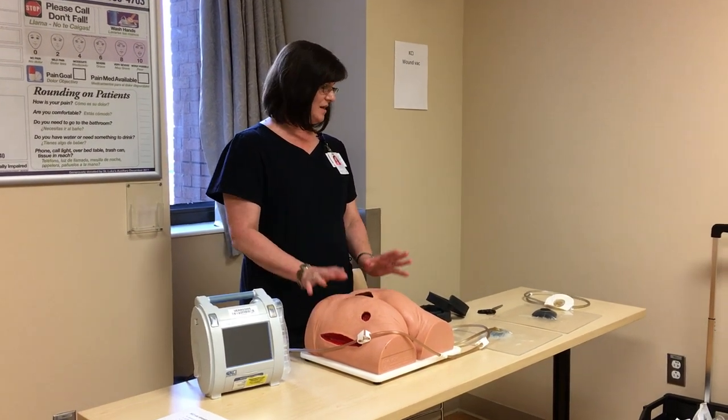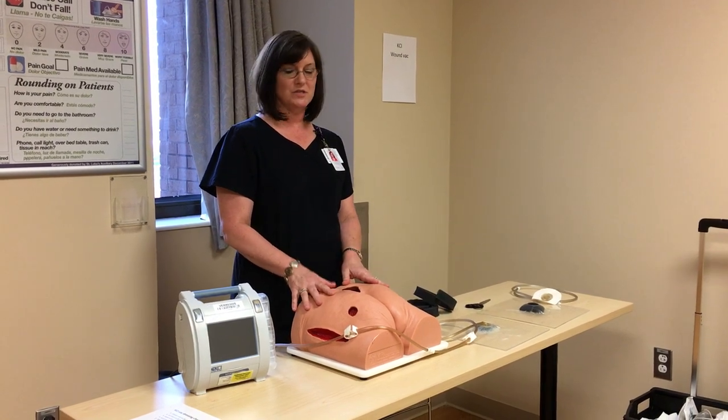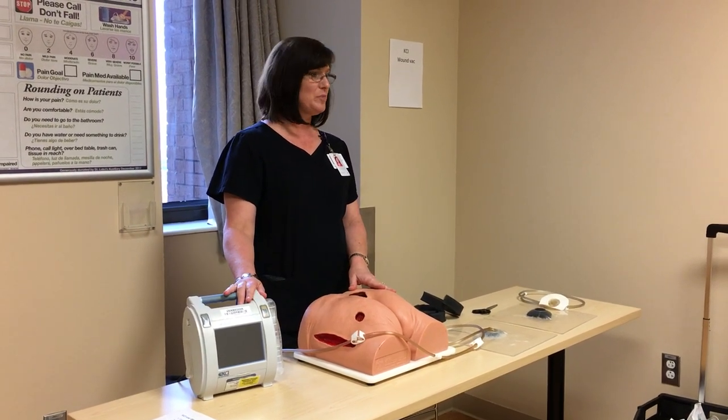I'm Tracy, I'm with KCI. I'm just going to spend a few minutes going over a basic VAC dressing with you today and some things about the pump.